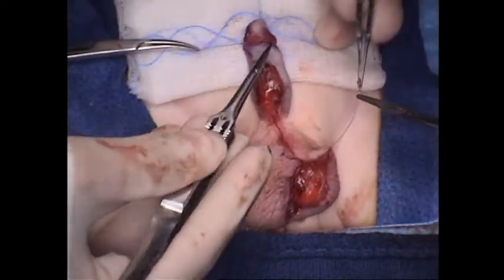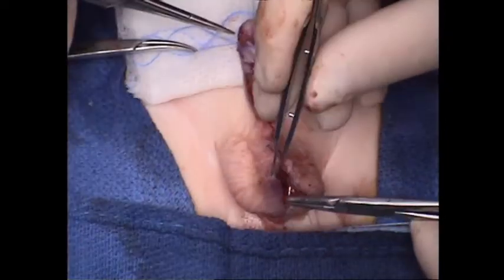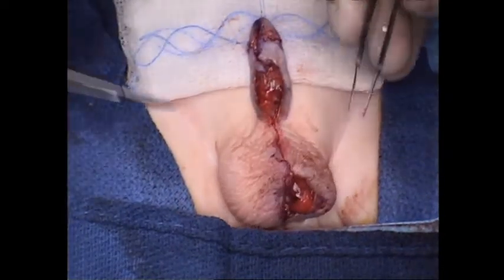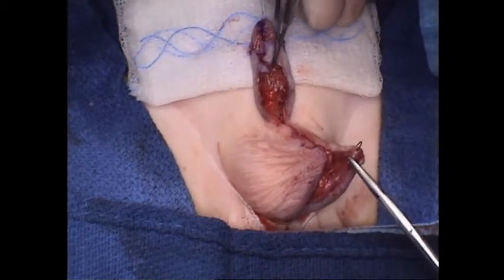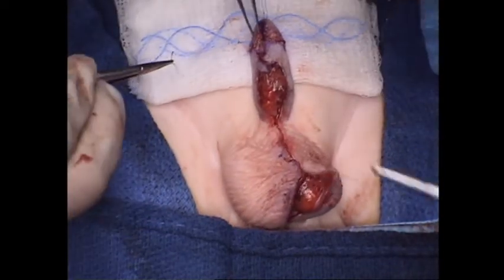Meanwhile, she's finishing up the skin to mucosal collar on the opposite side. And then we have to finish making the proximal urethrostomy, sewing the shaft skin to the urethral opening here, as you can see, and bringing this skin together. And then we'll be ready to put on the graft.